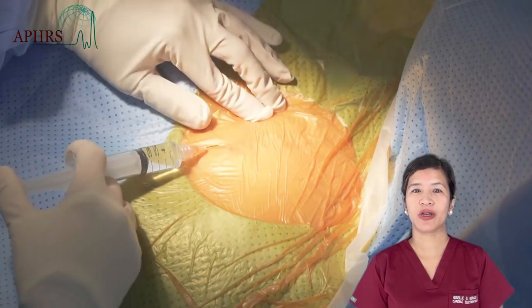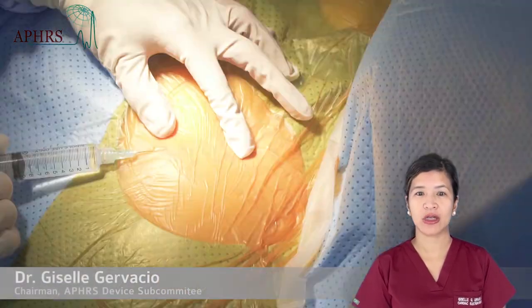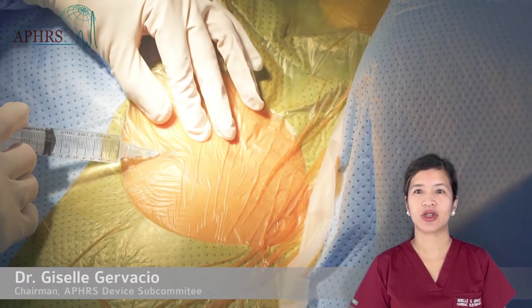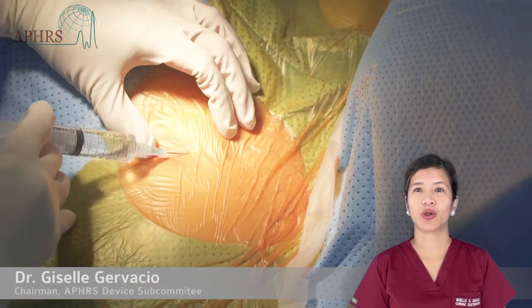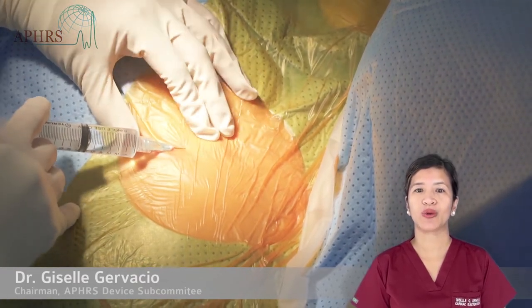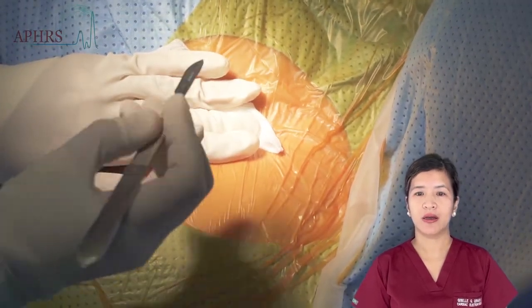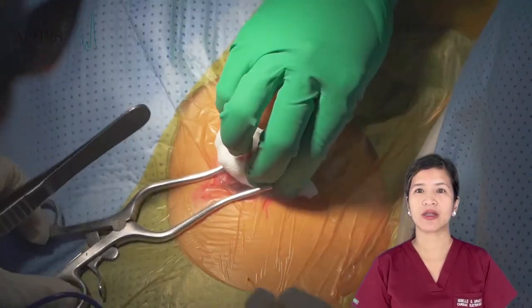Pocket dissection for generator replacement differs from de novo implantation in that care must be exercised not to damage the indwelling generator and implanted leads. In this short tutorial, I will be walking you through the steps in pocket dissection and giving some practical tips on how to avoid damage to the leads and generator.